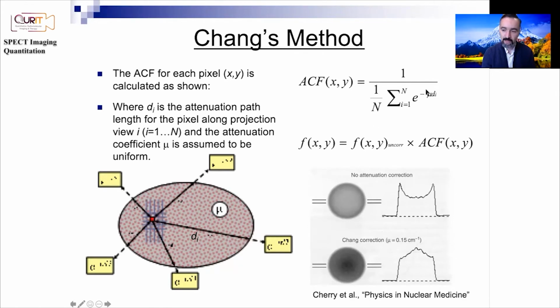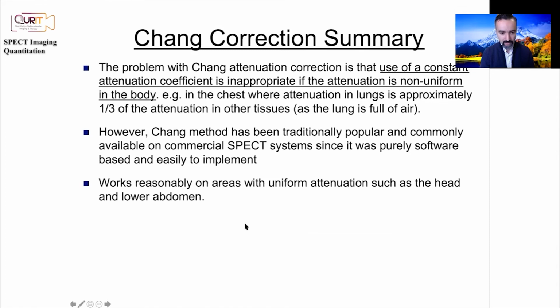So you can actually build a non-uniform mu map in here, calculate the attenuation along here given that non-uniform mu map, and then do the attenuation correction. So pretty much all you've done is upgraded this model where you're not assuming the mu is constant everywhere. You're getting help from a transmission scan or from a CT scan to understand the mu map.